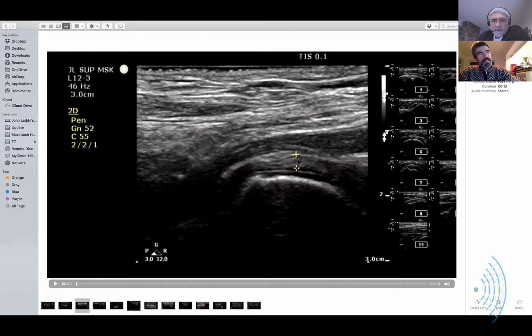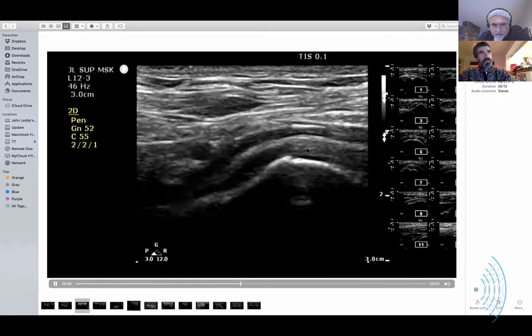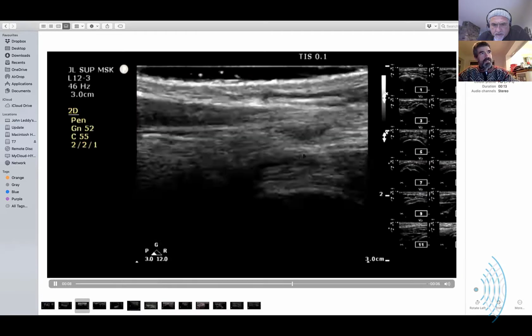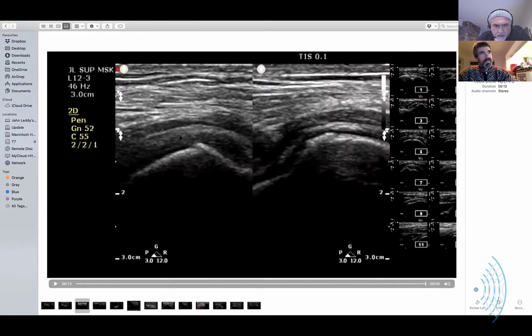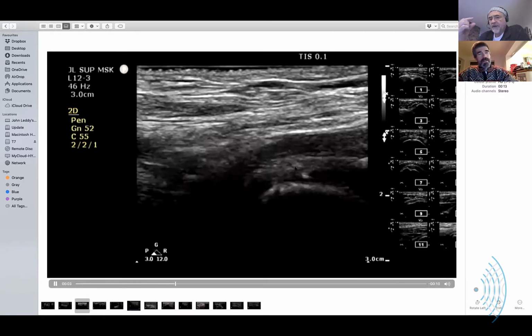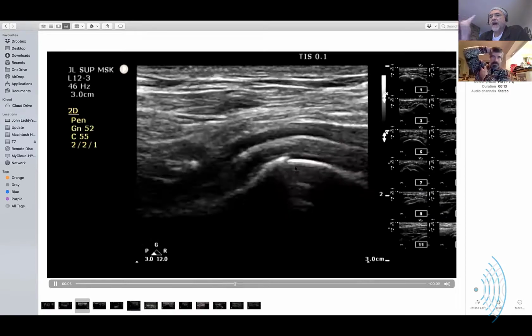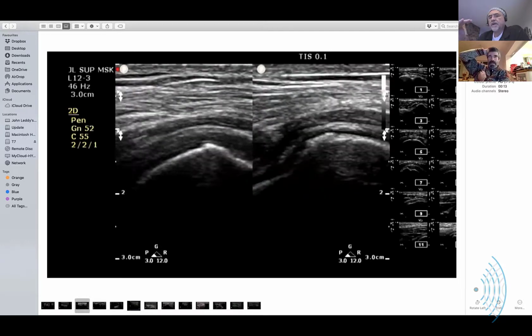I've been looking. This is the capsule, the inferior capsule here of a patient, and that's on the normal side. So normal side and thickened, and again, this is one of those stiff shoulders. Okay, now I need to get my head around this. This is the capsular fascia or tissue that is located under the rotator cuff tendons in the area. This is in the armpit.